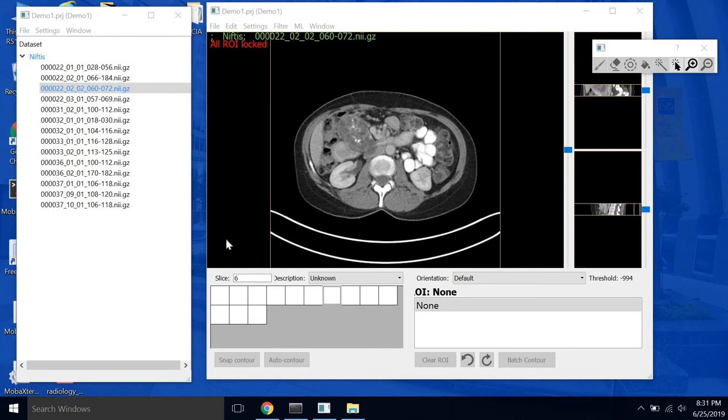In this video I'm going to show you how to create ROIs to start segmenting our medical image in RealContour. So you have to create an ROI before you can start segmenting.